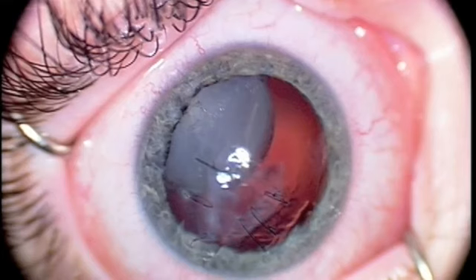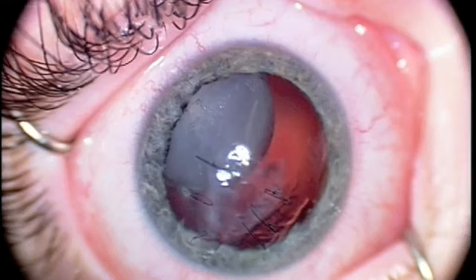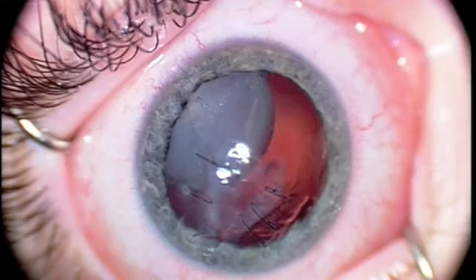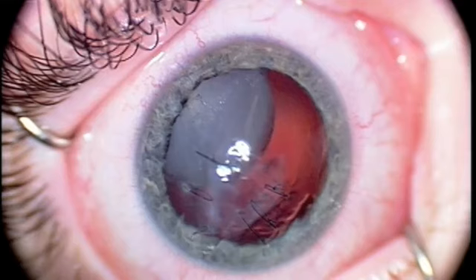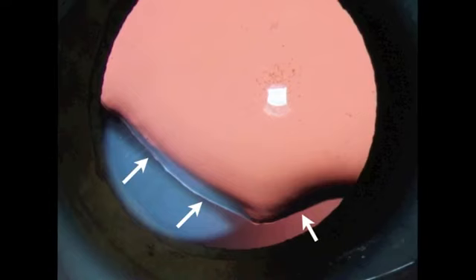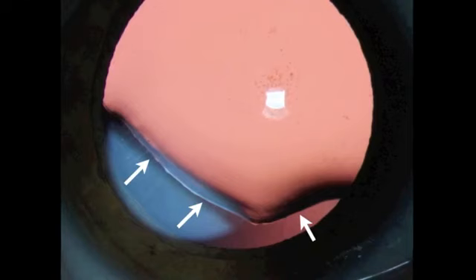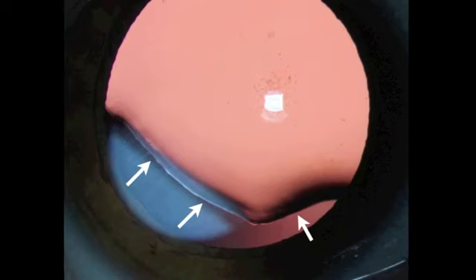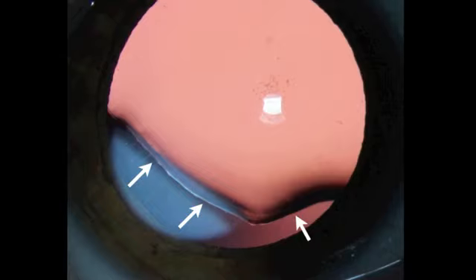The red reflex can also be used to detect abnormalities of lens position. Following trauma, this child has a white cataractous lens that is displaced up and to the left. Around the lens to the right, one sees a normal red reflex following surgery with stitches still in place. Here we see a child with Marfan syndrome. The arrows indicate the edges of the lens through which one can see a normal red reflex above. The lens has been displaced upwards. The whitish area down and to the left is an artifact of the photo.